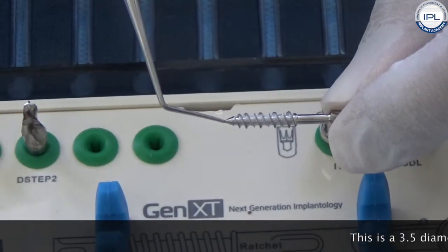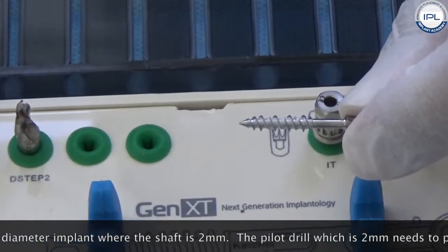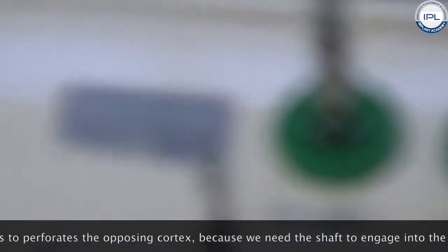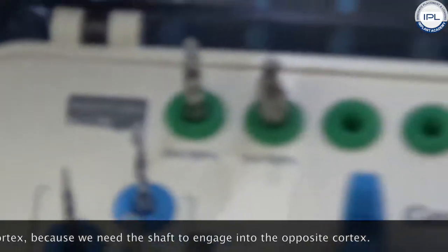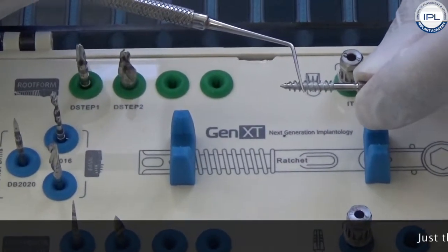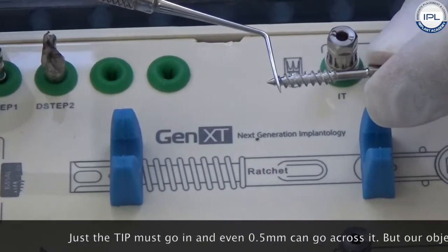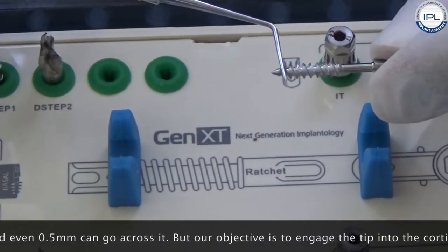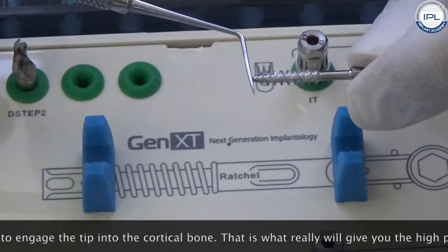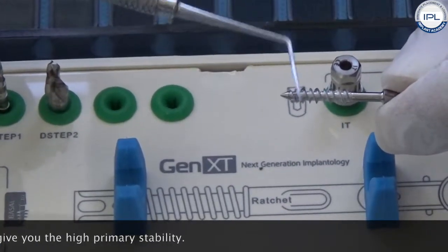This is a 3.5mm diameter implant where the shaft is 2mm, and that is why this pilot drill, which is 2mm, needs to perforate the opposing cortex — because we need the shaft to engage into the opposing cortex. By engage, I don't mean we have to go a lot; just the tip must go in. Even 0.5mm can be enough. Our objective is to engage the tip into the cortical bone, as that is what will give you high primary stability.